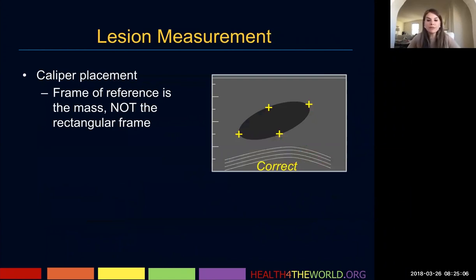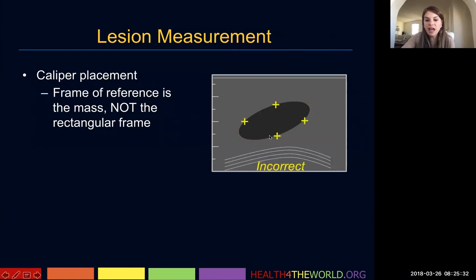When measuring a lesion, the frame of reference for caliper placement should be your mass, not the rectangular frame of your ultrasound image. Here you see the calipers have been placed correctly, along the largest axis of the lesion — this is the correct way to measure on breast ultrasound. Placing calipers relative to the ultrasound image frame would be incorrect. You really want to measure based off the mass itself.